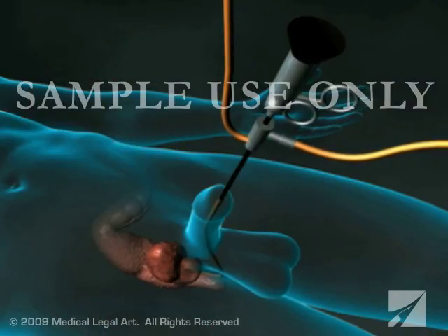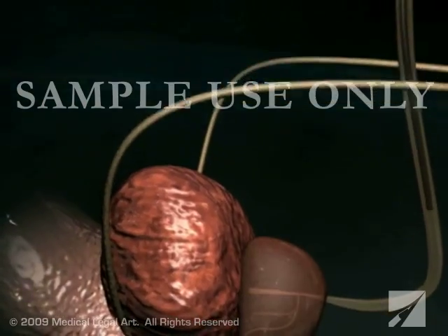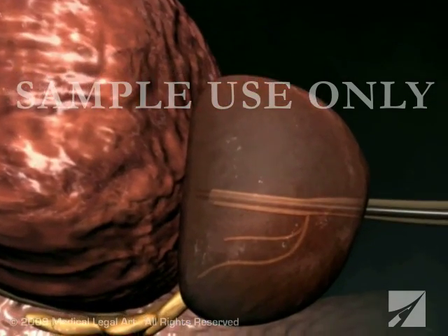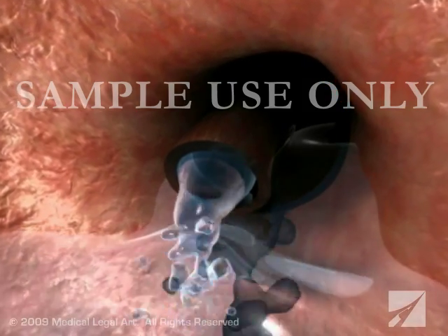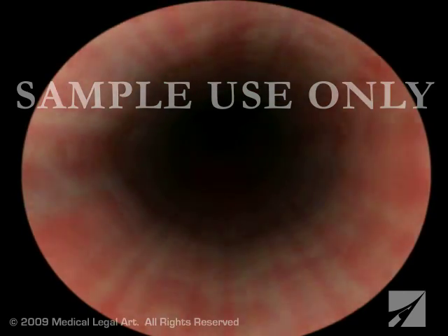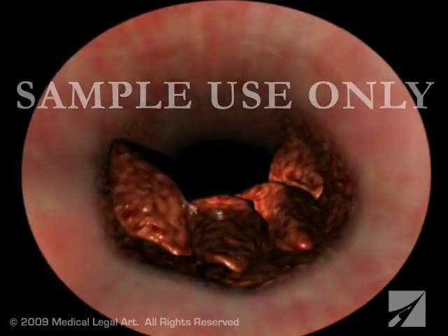Your surgeon will begin by slipping a small, lighted instrument called a cystoscope through the opening of your penis. After instilling sterile solution through the cystoscope for better visibility, your surgeon will carefully examine the inside of your urethra, prostate, and bladder.